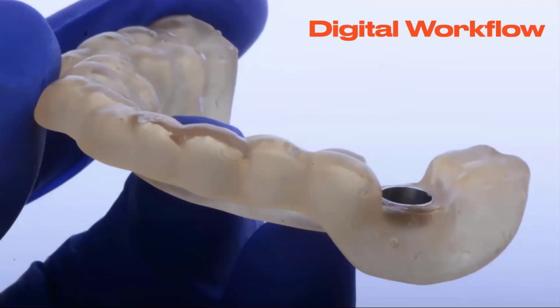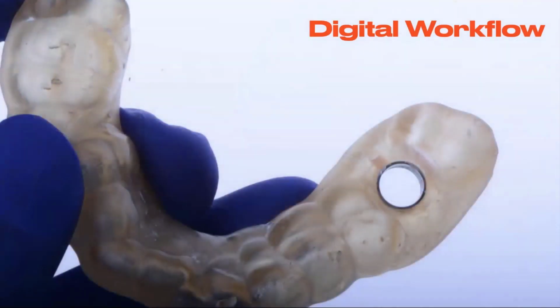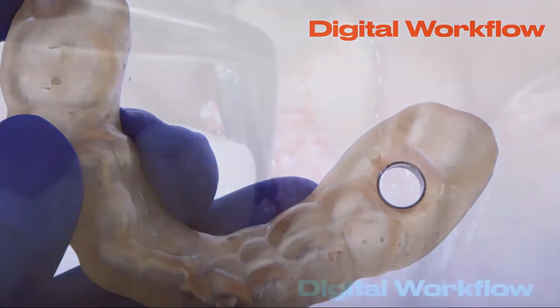And to get the most out of cone beam technology, and to get the most out of this type of modality and this type of treatment, we've got to make sure that we walk ourselves through the workflow, but also utilize the technology. So those of you that do any kind of guided surgery and then don't place the implant through the guide, you're actually missing out a lot on the accuracy that would be there from the surgical guide. You can see the guide is full arch because it's got to be printed specifically for the digital workflow.